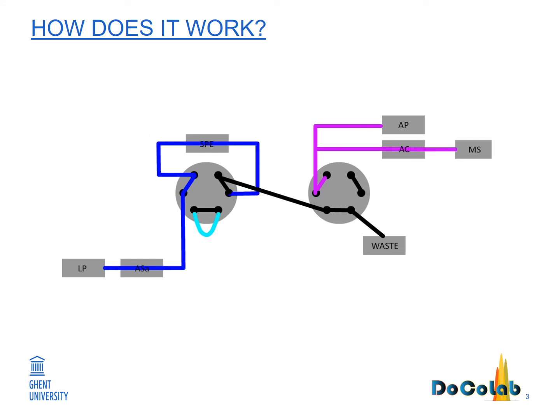On top of this online cleanup, we use a turbulent flow rate to load the samples, to clean them up even more. Comparing a turbulent flow rate and a conventional LC flow rate for the online SPE showed that the turbulent flow rate was more effective in removing matrix interferences. By applying an online cleanup, matrix effect and retention time shifts were reduced compared to a dilute-and-shoot approach.